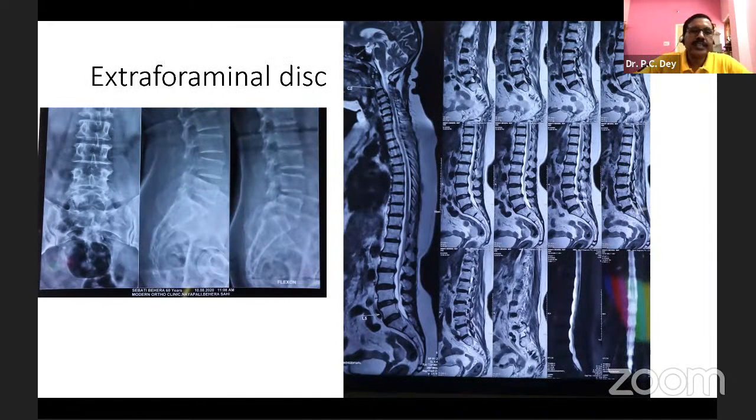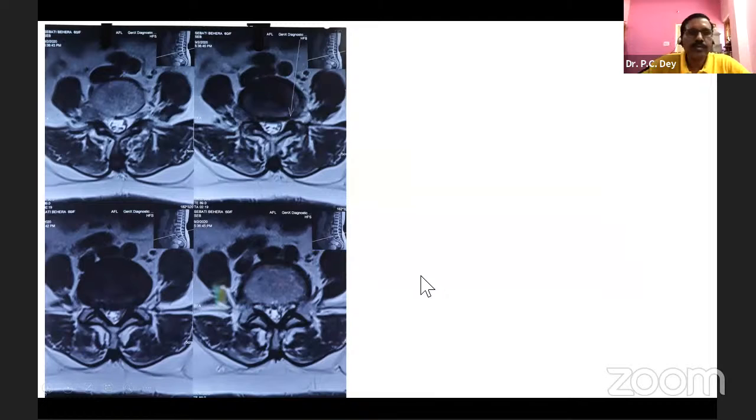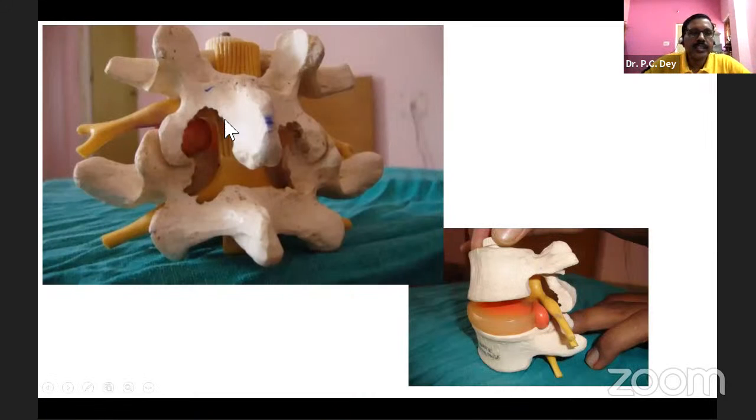Now another patient has an extraforaminal disc. This MRI and X-ray seem to show nothing much of a problem, but in the axial view, it is a huge extraforaminal disc at L4, L5 on the right side. So this is not the regular interlaminar approach. It is an approach from the foramen or extraforamen. This is the isthmus, and this is the lateral aspect of the inferior articular facet.